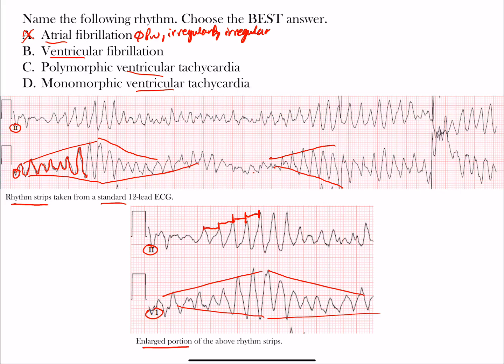Ventricular fibrillation is a tricky one because if you look here, it kind of looks like these are all fibrillatory waves. Looking below, you may see more consistency, but some of these look like they may be almost imitating ventricular fibrillation. When we look at the whole rhythm and choose the best answer, ventricular fibrillation is not correct here. With ventricular fibrillation, you just have fibrillatory ventricular waves but no clear QRS complexes being formed. So V-fib is not correct either.